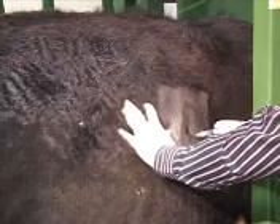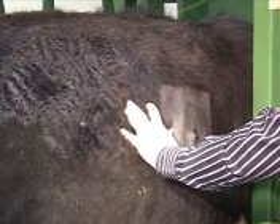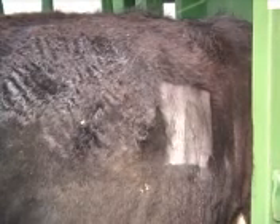I'll actually go down into the muscles between the ribs and deposit about a cc, and then as I pull the needle out, I'll leave myself a bleb under the skin. That's exactly where I want to go with the scalpel blade. I'll give it a couple of minutes to numb.